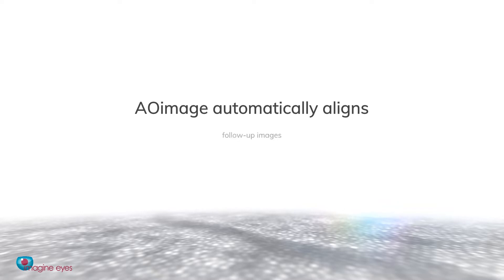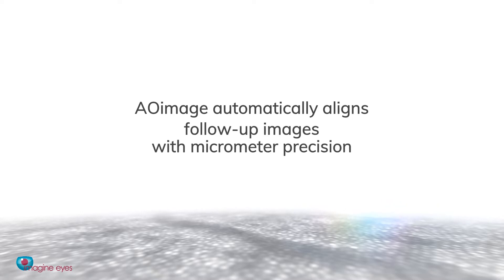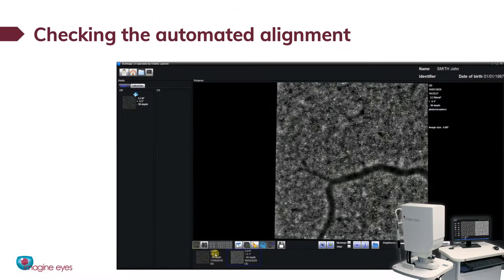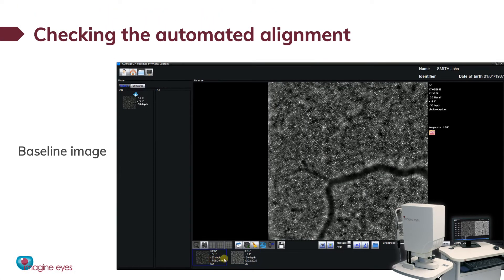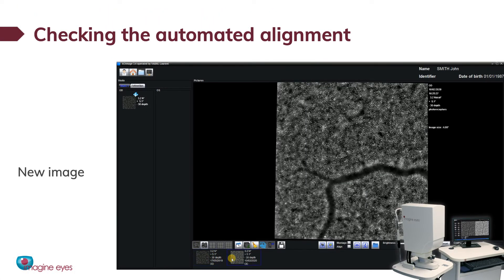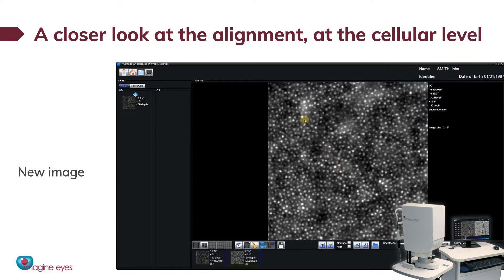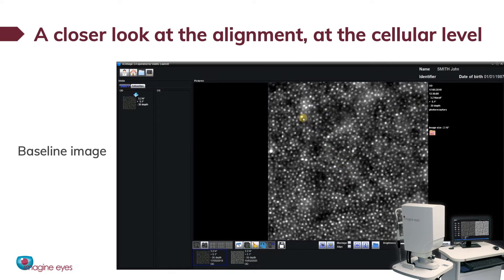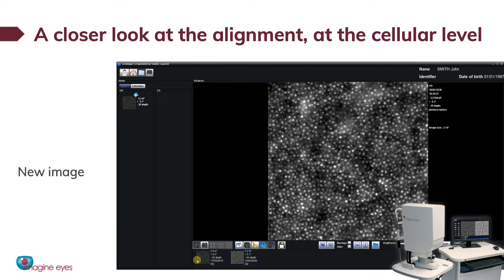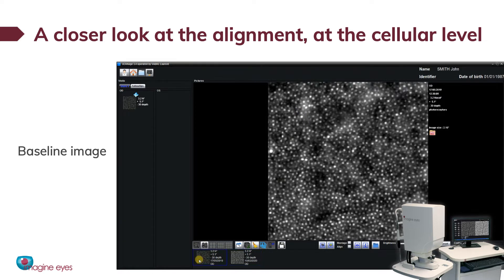AO Image automatically aligns follow-up images with micrometer precision. By switching between the baseline image and the new image, we can see that vessel shadows are perfectly aligned. Taking a closer look at the cellular level, we can switch between follow-up images and confirm that even cone cells are aligned.